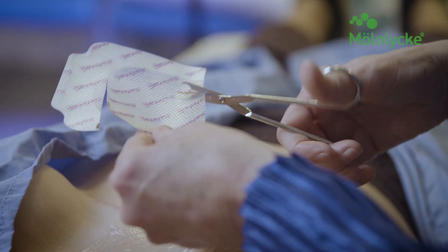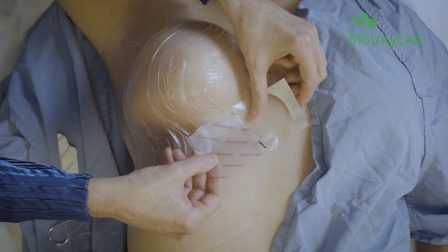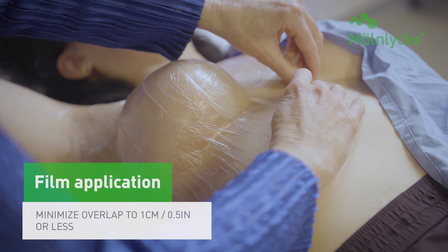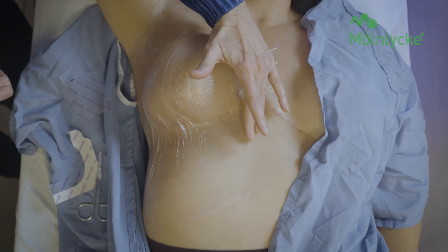Small areas of Mepitel film can lift over time due to wear and moisture. Ensure the patient understands that it's safe to trim and patch the dressing as needed, as long as there is minimal overlap of dressing edges and the dressing is applied while the patient is in the same position assumed during radiation treatment.